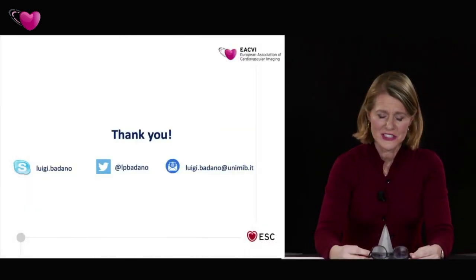Thank you very, very much, Luigi. I think this is a very interesting topic, and when we look at the community, there are very, very many clinical questions. So one of the key questions is, of course, the very clinical one. It's from Belgium. Do we assess RV strain in every patient or in selected patients?